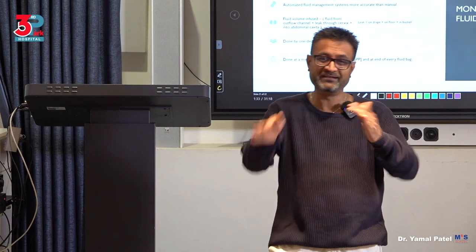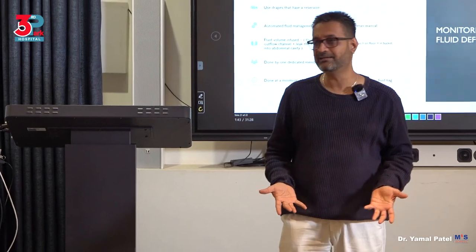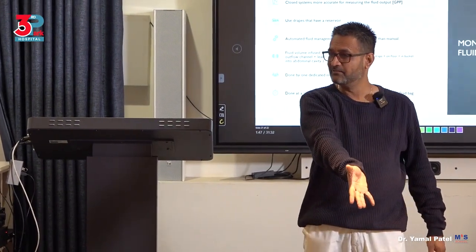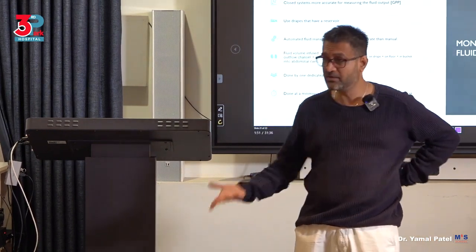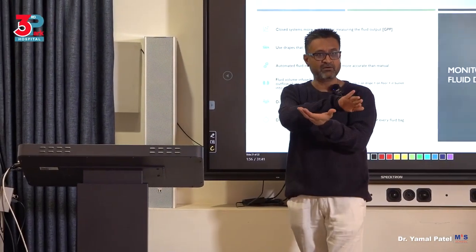You have to turn it the other way around so that the blue part is on top, so the water just flows into the basin, not absorbs. When you absorb, you don't know how much is absorbed in that blanket of yours. How do you calculate? So operative work, you should be doing it the other way around.